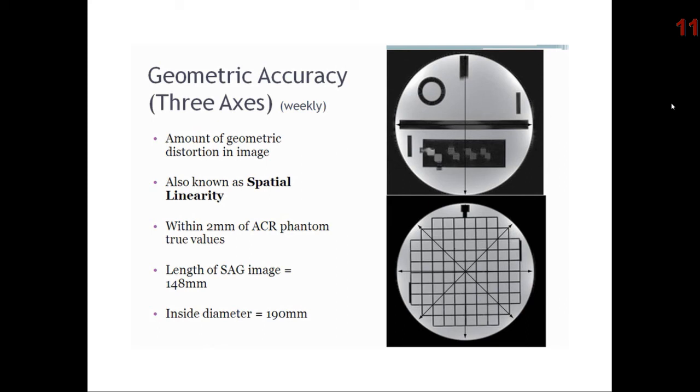Geometric accuracy will also indicate the accuracy of the scanner distance measurement tool that can be used to verify the reported field of view. Field engineers usually perform geometric accuracy tests during the scanner's regularly scheduled preventative maintenance, or PMs. Reshimming the magnet or removing ferromagnetic objects such as paper clips, coins, or bobby pins from the magnet bore can increase the MRI system's performance.